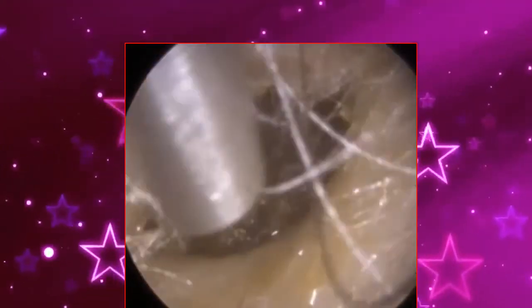So I'll call this a grade 0 if I'm honest. But you get different grades. There is no grade 0. I'm trying to create that one myself. So grade 1 is the mildest form of keratosis obturans. Well, you could classify this as grade 1, I suspect, but the patient didn't have any pain. Characteristic of keratosis obturans is a bit of pain and widening of the ear canal. So I wouldn't even say the patient's got a significant widening, hence why I was calling it a grade 0, but if it had been left any longer, it would have been a grade 1.